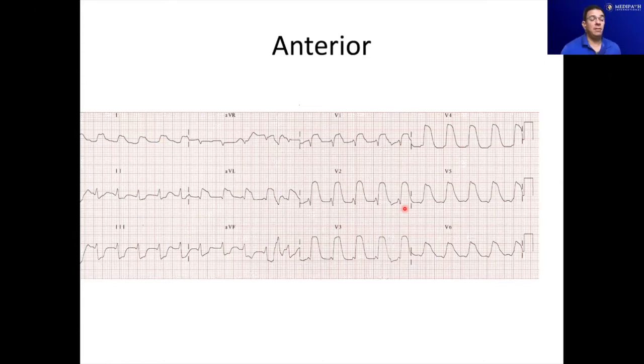So this was a very brief hour; each 20-minute section that I did is usually extended as you're learning over your careers. You can't teach someone everything about an EKG in 1 hour, but this was kind of an introduction to some of the things we look for when we're looking at EKGs in the emergency department or on the floors or in a cardiology office for signs of danger to patients.